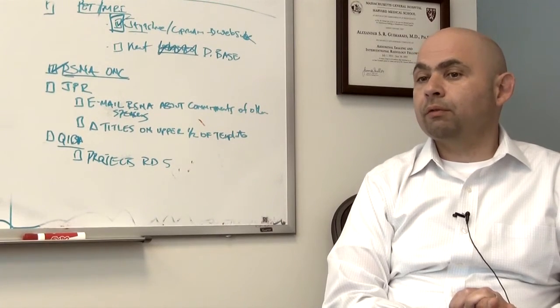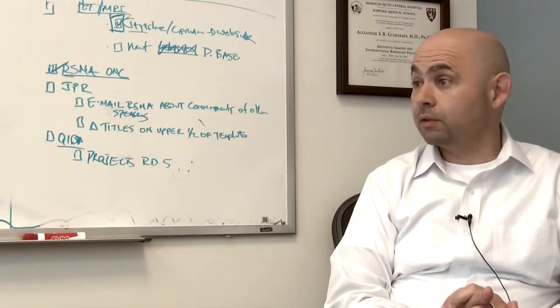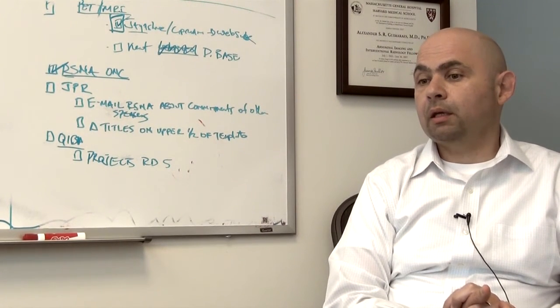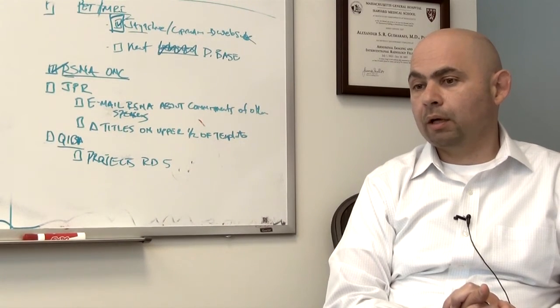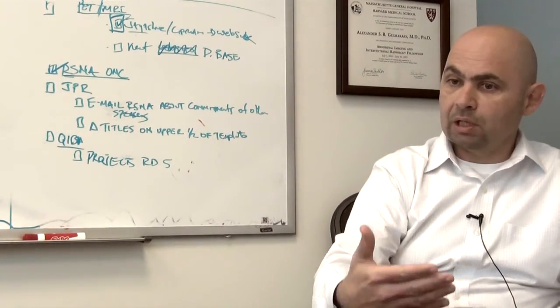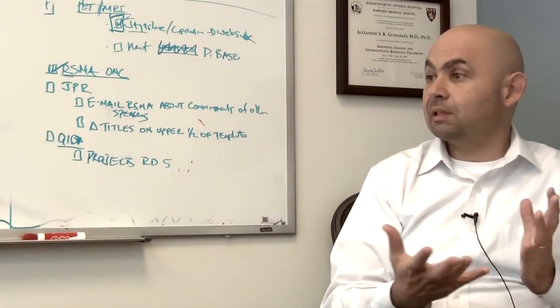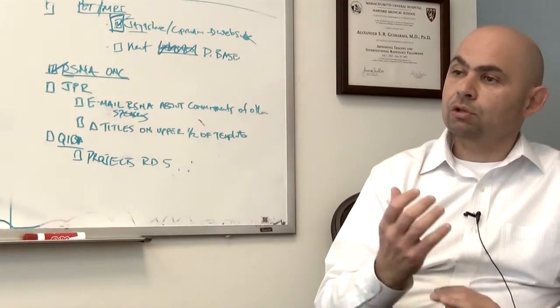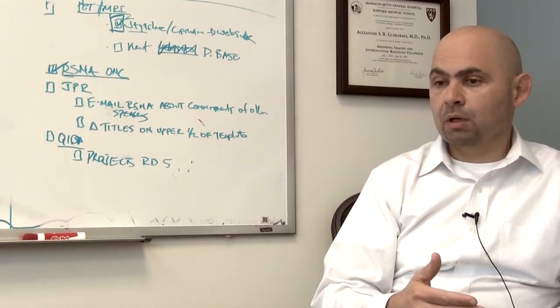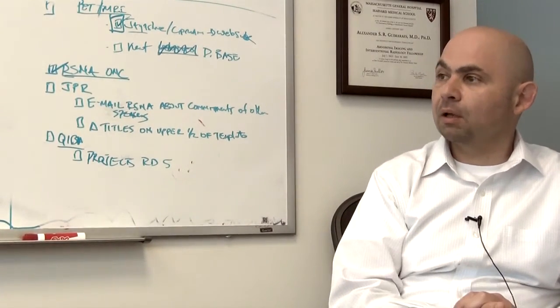There has been no known evidence of a deleterious effect from exposing human cells or patients to high magnetic fields. The only risk factor associated with MRI is heat deposition: you transmit energy into your system, and then receive it back with the receiving coils. Depending on the amount of energy deposited and how quickly you transmit that energy, you can deposit some level of heat.